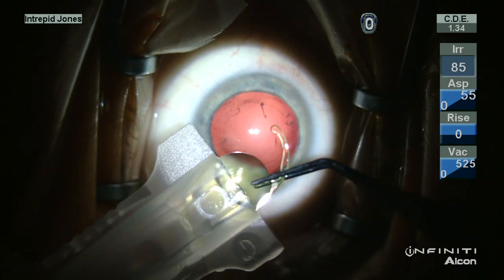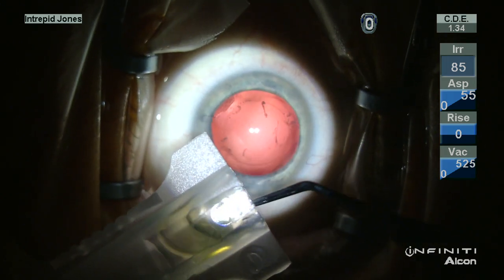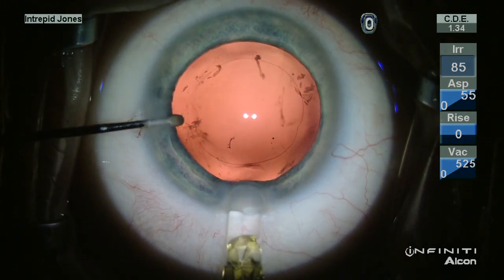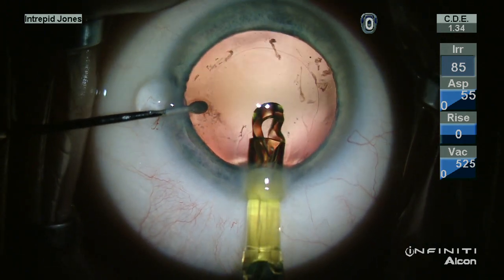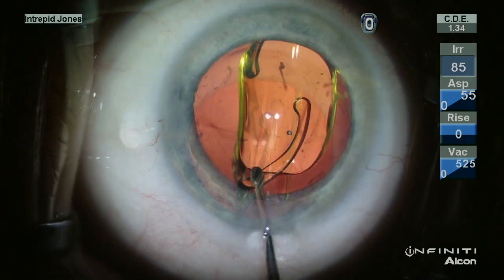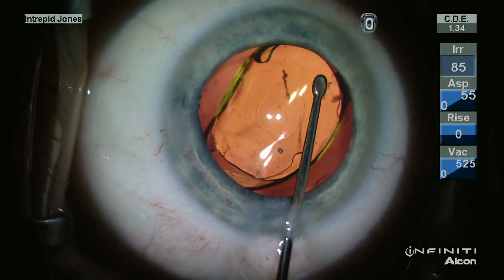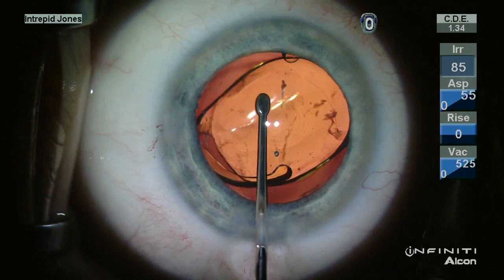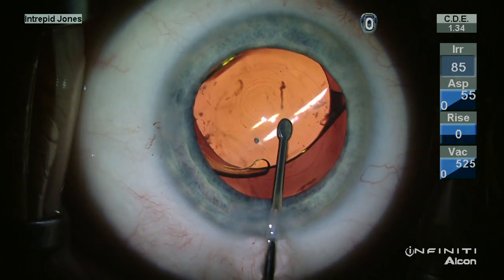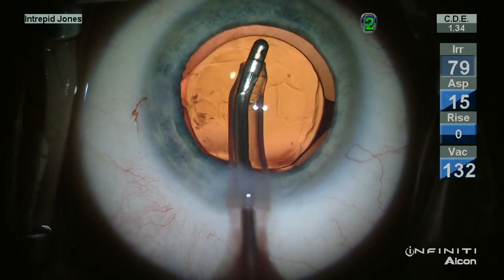Additional OVD is placed in the nasal fornix of the bag and I then load the single piece lens into the D cartridge myself, allowing me to visualize the lens and inspect it. This cartridge and ejector system easily places this lens within the remaining capsular membrane.